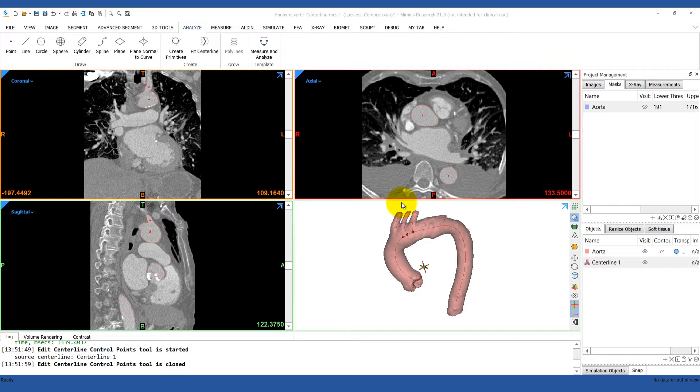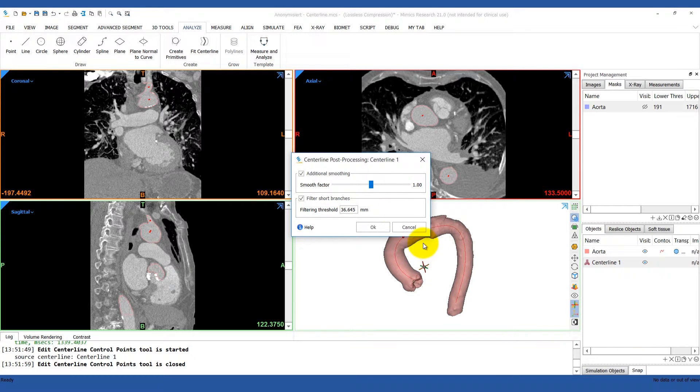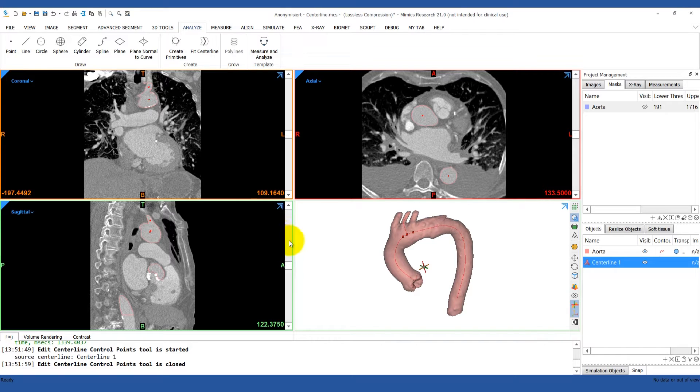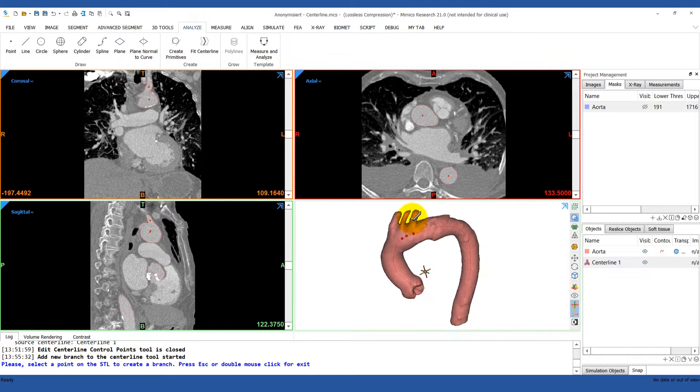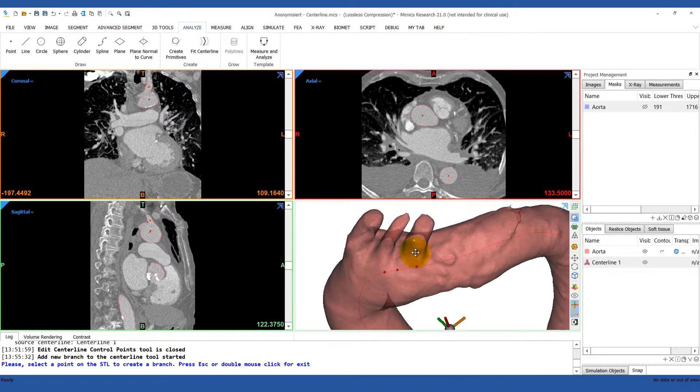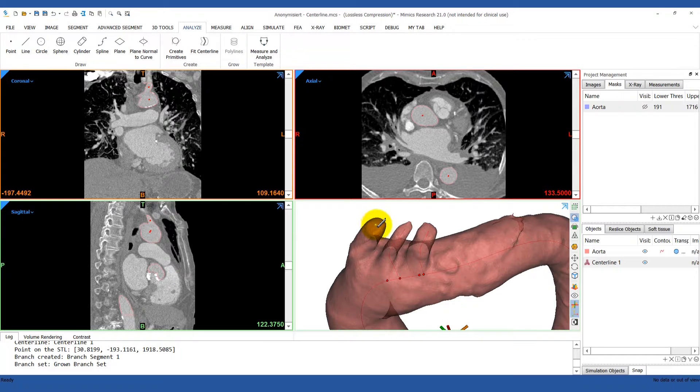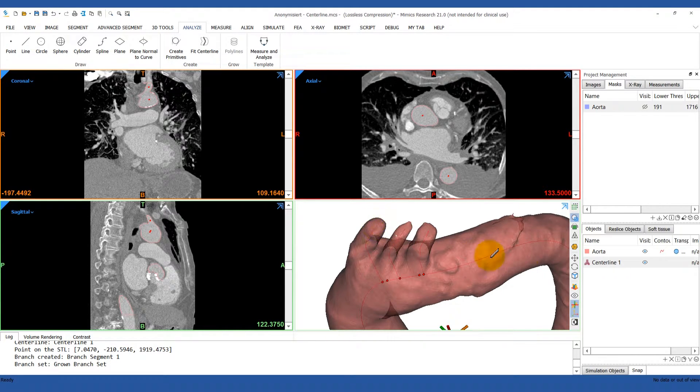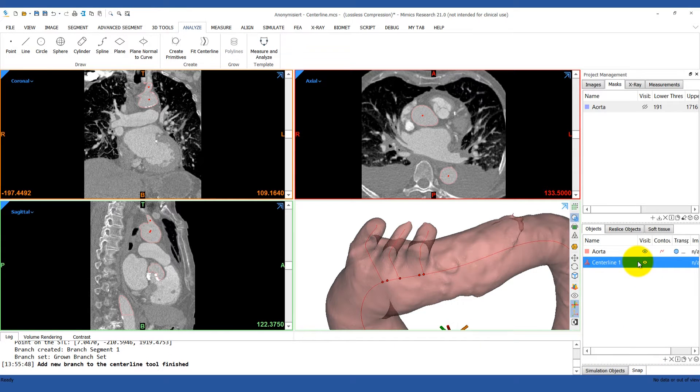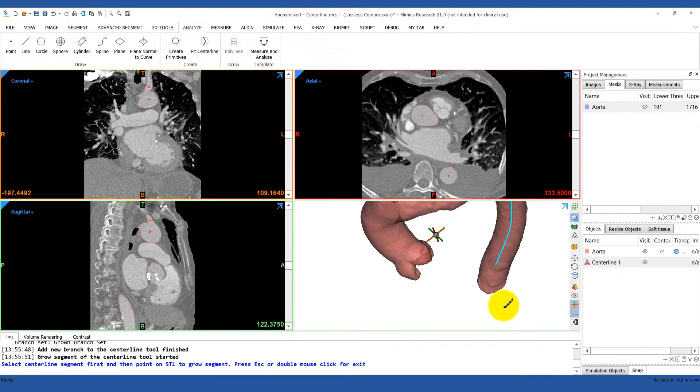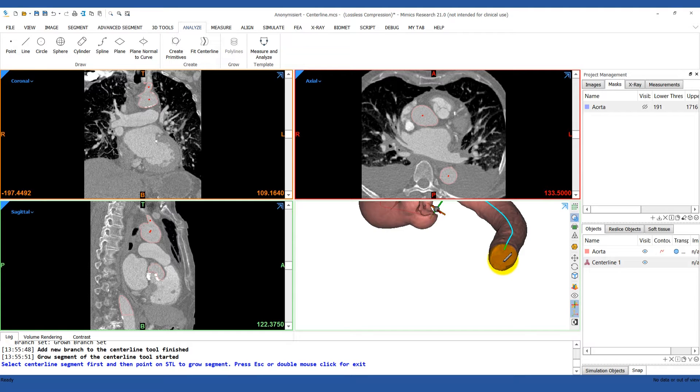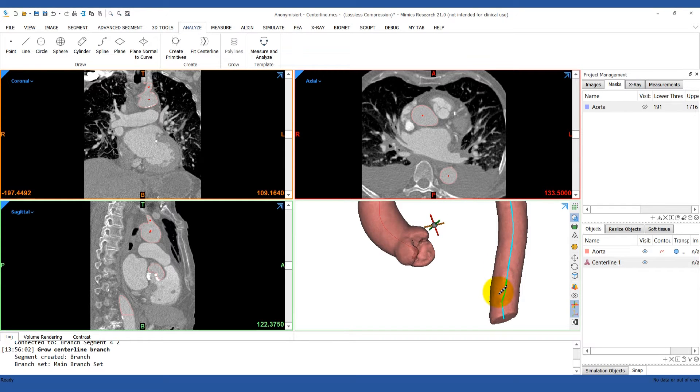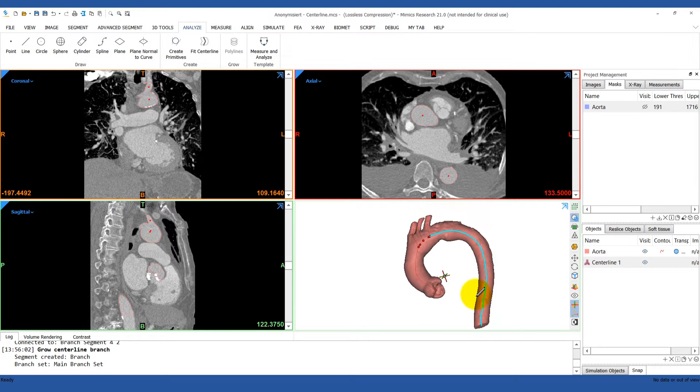There are also some centerline post-processing features. If the centerline didn't come out quite smooth enough, you can adjust the smooth factor or filter out shorter branches. In our example here, it looks like the software calculated some of the branches for the arch vessels, and two of them must have been smaller than the distance that was set. If you want to add any missing branches back in, you can click Add Branch to Centerline, and then just click on the endpoint of that branch. It will recalculate that centerline part for you. You can also grow a segment of the centerline if it didn't go all the way through the vessel. Just click on that segment and then pick a point for it to grow to. It's clear that there are a lot of advanced tools that you can use to refine the calculated centerline.